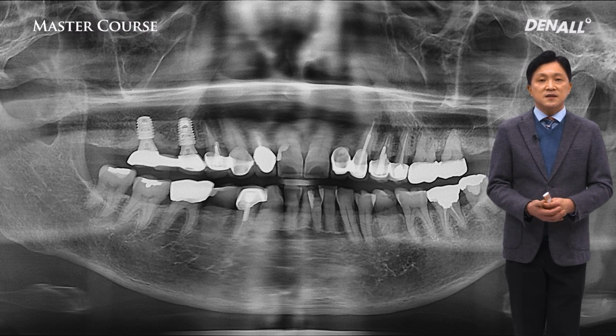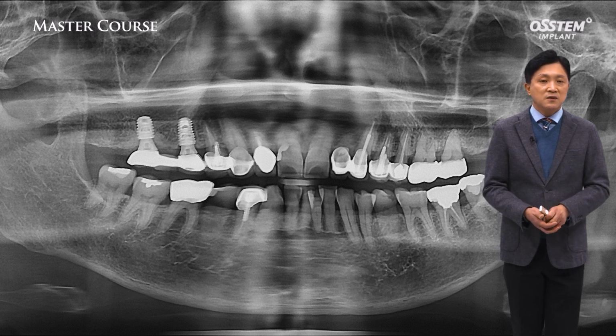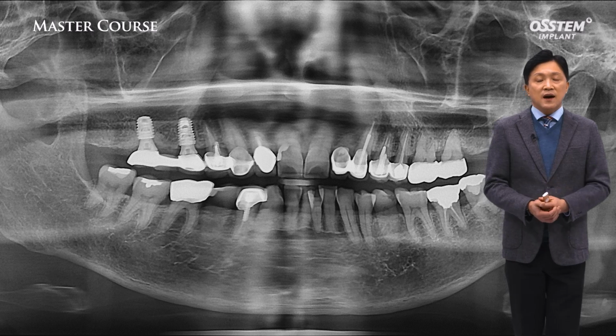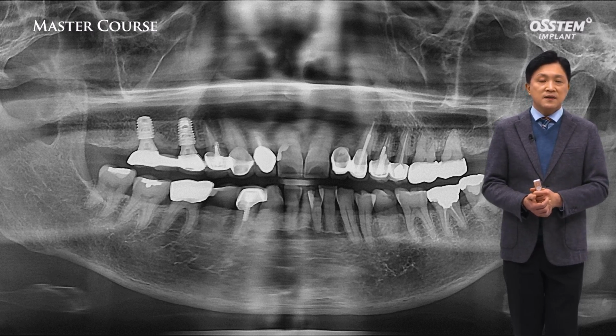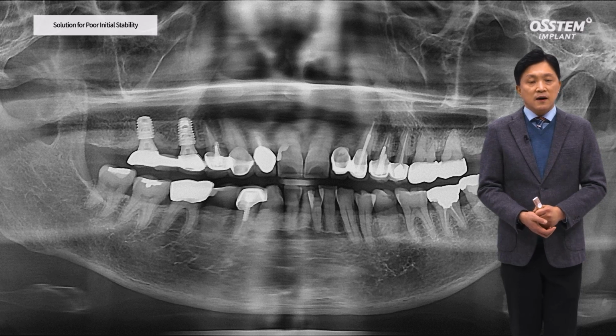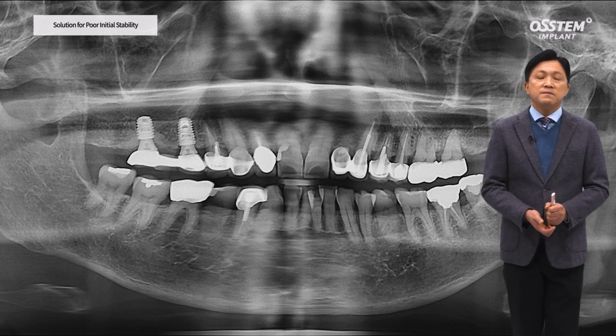The osseodensification method is useful in increasing initial stability. I agree with that, but if we use one-size undersized drilling, I don't think there is a difference between that approach and osseodensification. I don't believe there is any difference between those two.